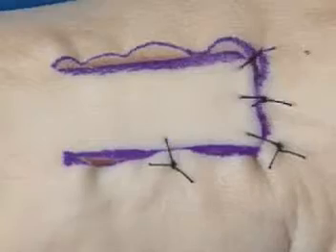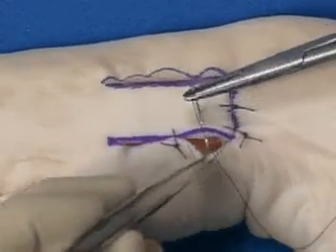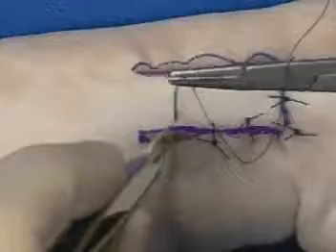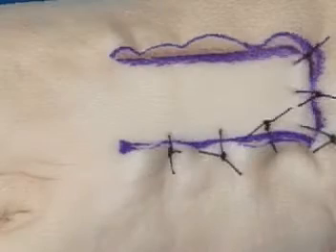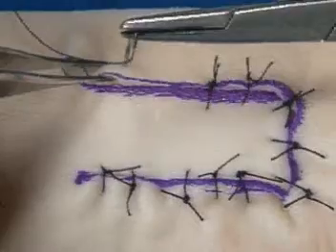The two halves on either side are still uneven, but less so. Subsequent sutures are then placed so that it splits the difference between the previous sutures until enough sutures are placed for adequate closure. In this way, the redundant skin of the lower flap is spread evenly across the entire wound closure and results in a smooth wound edge.